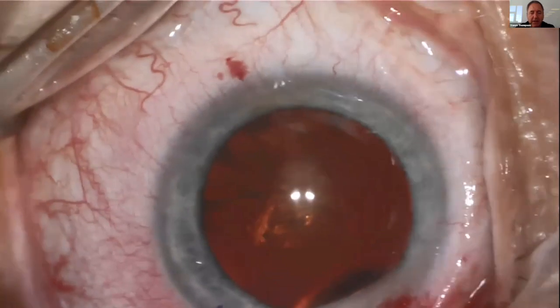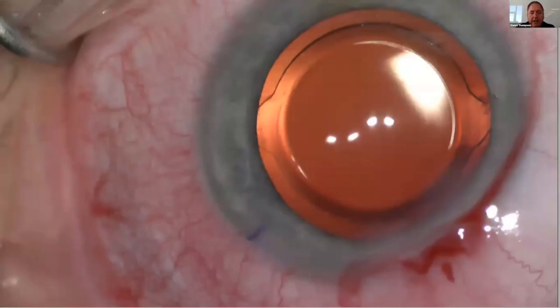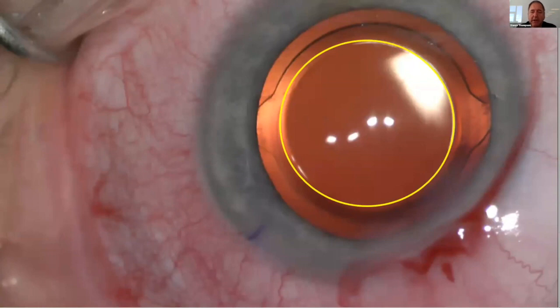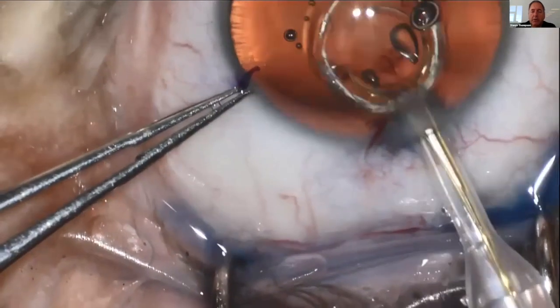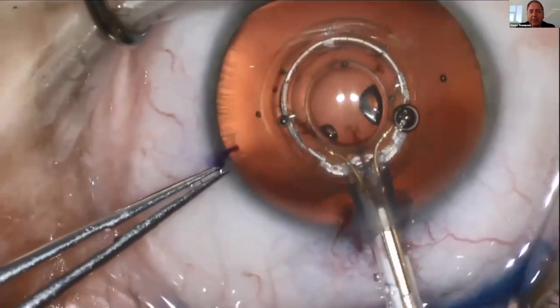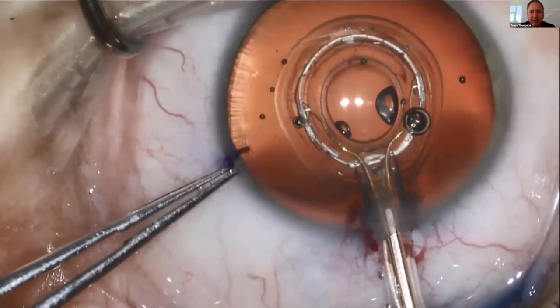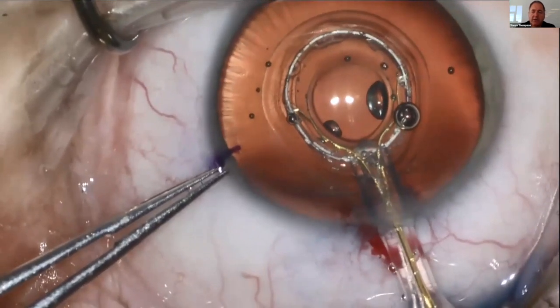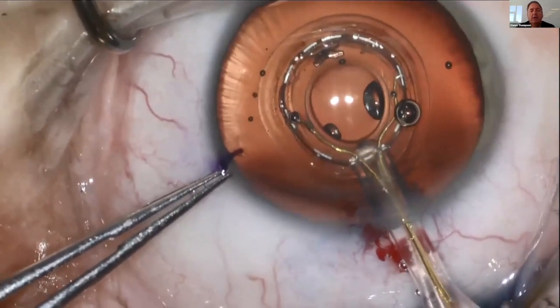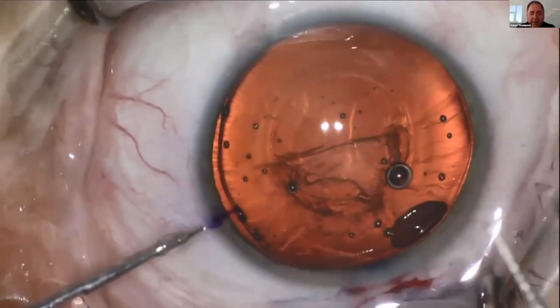We all know how important this step is. But when you're doing it manually, you are following a corneal mark to do a lens-based procedure, so you're constantly having to adjust for parallax. Zepto was developed with a push rod to push the silicone housing and the nitinol ring into the anterior chamber, using the same Purkinje method. I have Purkinje 1 and 4 aligned perfectly, then I ask for suction, the silicone housing sucks beautifully to the anterior capsule, I deliver the energy, and we release with a flush of BSS — which actually creates a nice auto-hydrodissection.